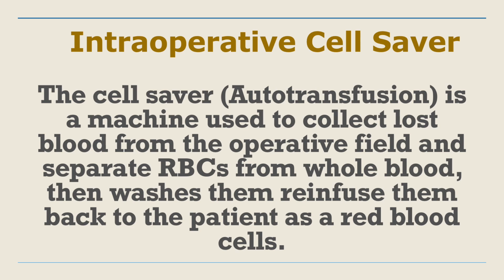Operative cell saver. The cell saver autotransfusion is a machine used to collect lost blood from the operative field and separate RBCs from whole blood, then wash them and reinfuse them back to the patient as red blood cells.